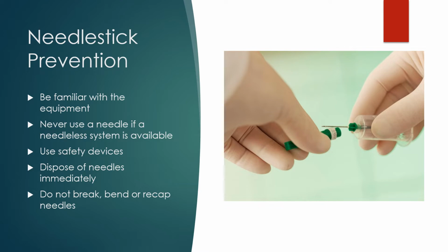Remember, we never want to leave an exposed needle. Maybe I'm beginning to stick my patient, something happens, and I want to set my needle down. We never leave that exposed needle. I would need to cover that needle back up, and then remember, and we'll talk about this in lab, we always scoop it back into the cap to cover it safely.